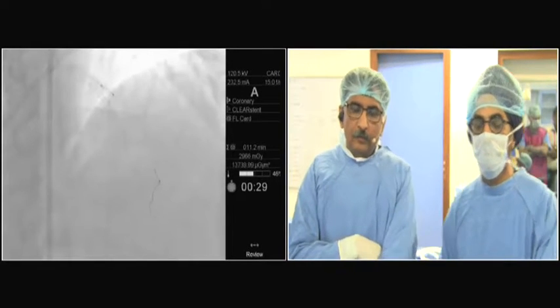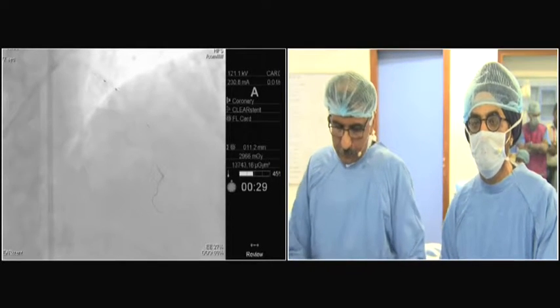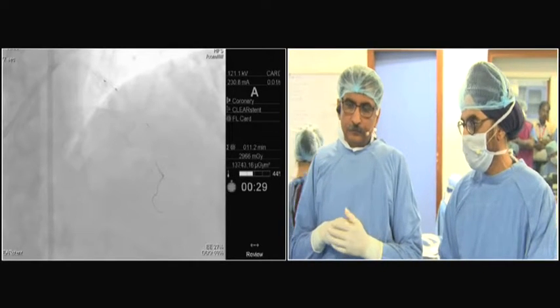I had gone into the LAD before I had actually taken this wire. So go up 10, 12, 14.